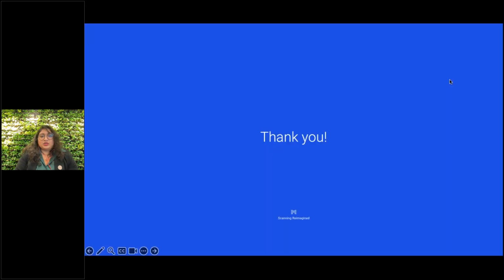So to conclude with a few closing remarks, one of our users who had been trying out the beta version shared this feedback with us. The new beta version seems to fix a load of issues I had with the old version. It makes the new version 10 times more usable. We really hope that you'll feel the same about this.